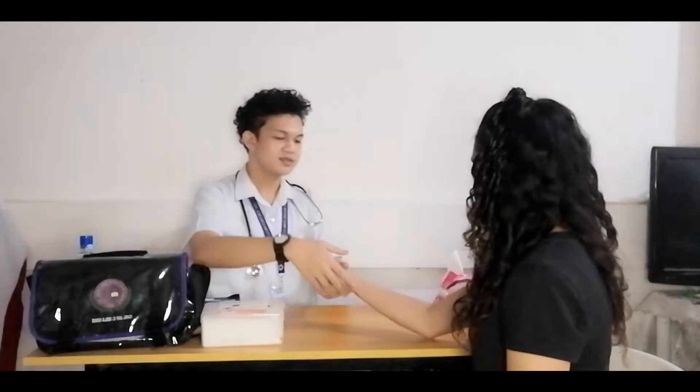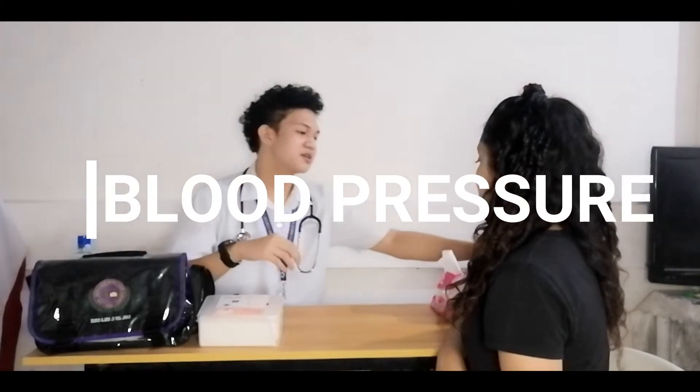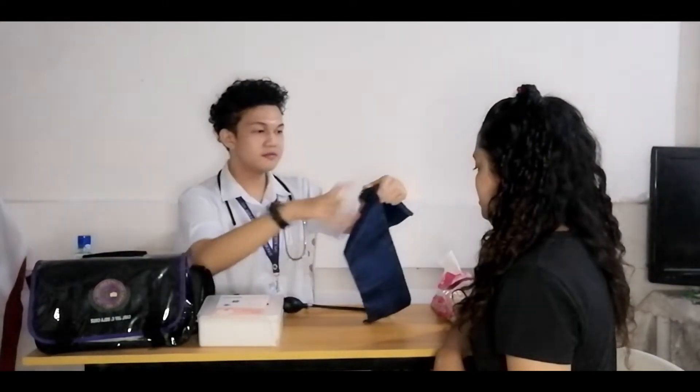All right, thank you. It's done. Ms. Cindy, your axillary temperature is 35.6 degrees Celsius, which is under normal temperature. This time I'll be taking your blood pressure. You don't have to worry at all — you'll just feel a bit of pressure.